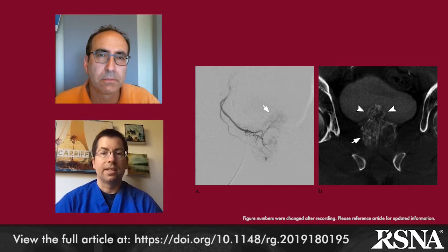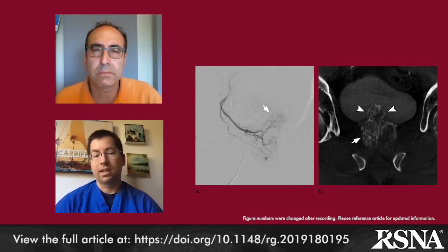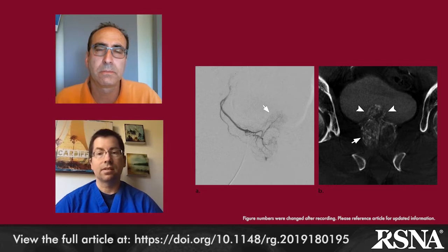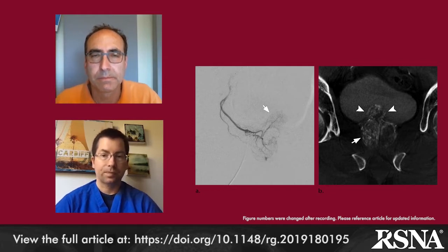These vessels should be identified and avoided if possible. This may be done with microcatheter positioning. If a safe position cannot be obtained, then the vessel itself may be selected and coil embolized to prevent non-target embolization, which would itself result in ischemic proctitis and other complications.